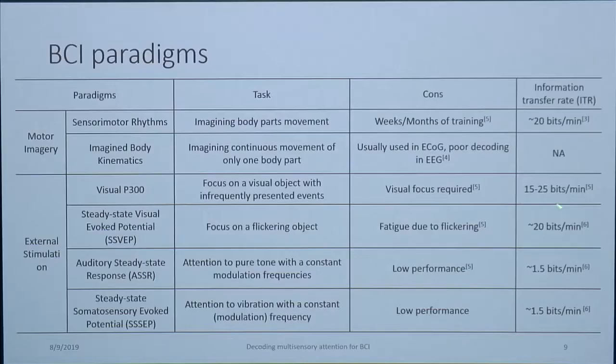For example, if I give you a string of green objects, and all of a sudden I give you a red one, the response corresponding to that red one is an infrequent event. And that waveform could be captured to use in BCI applications. And the advantage of using visual attention is the performance is pretty good, comparable to the motor imagery. And we don't need training. If I ask you to stare at one point, you don't need extra training to do that.